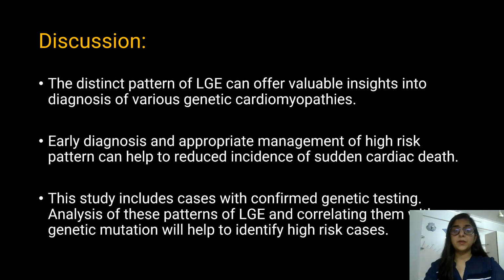The distinct pattern of LGE can offer valuable insights into the diagnosis of various genetic cardiomyopathies. Early diagnosis and appropriate management of high-risk patterns can help to reduce the incidence of sudden cardiac deaths. This study includes cases with confirmed genetic testing only. Analysis of these patients' late gadolinium enhancement and correlating them with genetic mutation will help to identify high-risk cases.